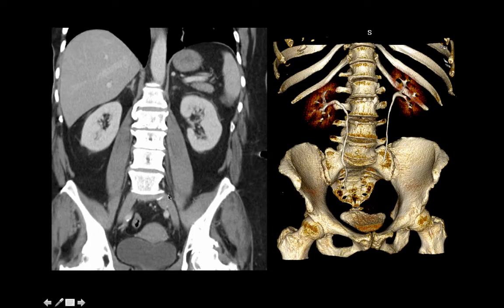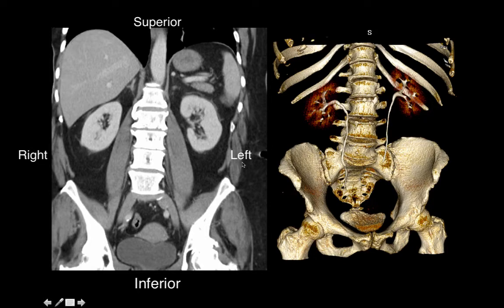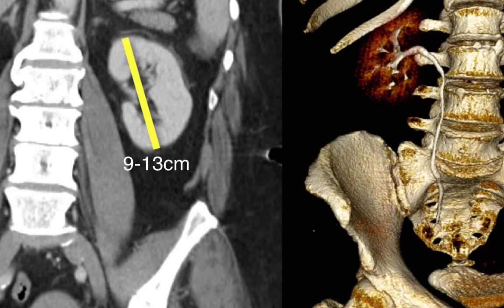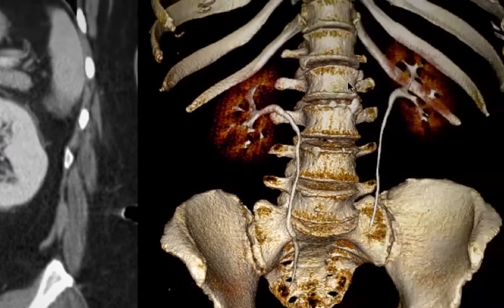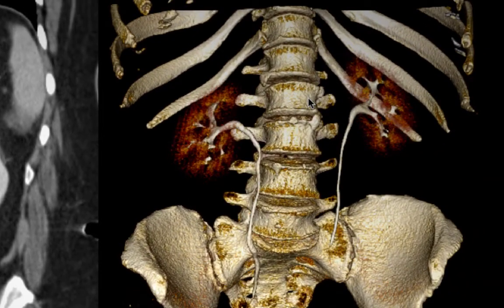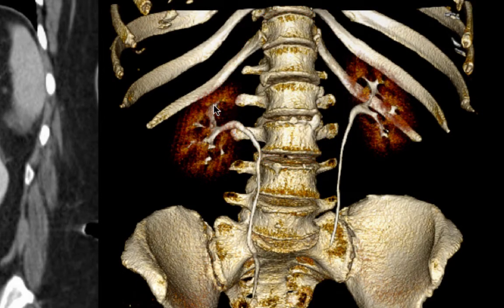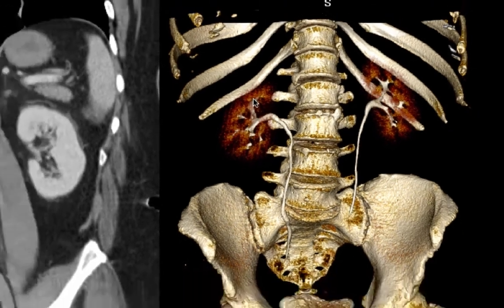These are coronal images of the abdomen — head at the top, feet at the bottom, right and left labeled. A 3D rendered image from this imaging dataset shows that the kidneys are typically about 9 to 13 centimeters in length and about 5 centimeters in width. They span the T12 through L3 vertebral bodies, with the left kidney being slightly more superior compared to the right due to the presence of the liver on the right side.